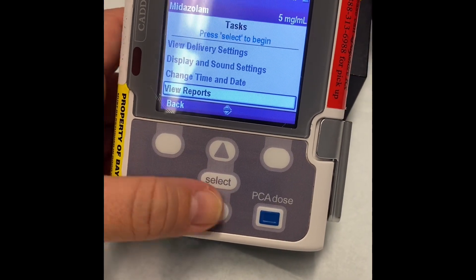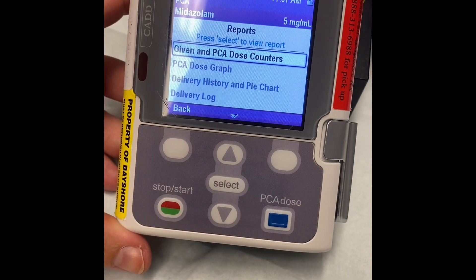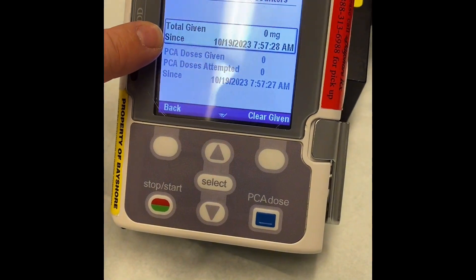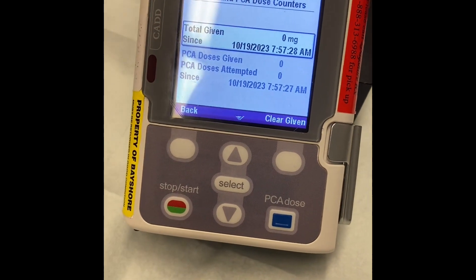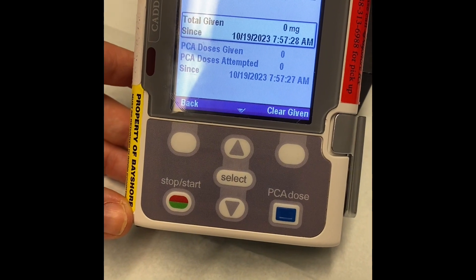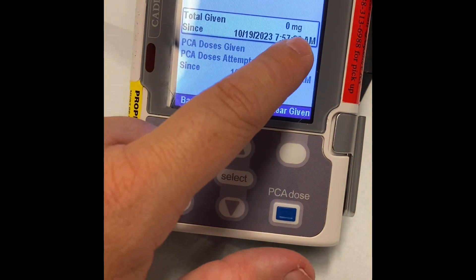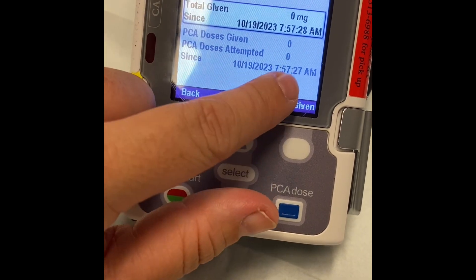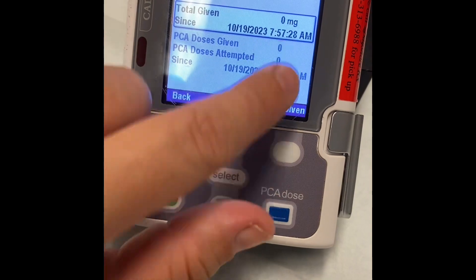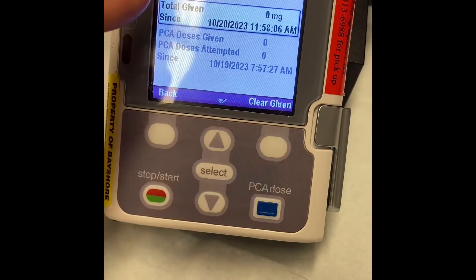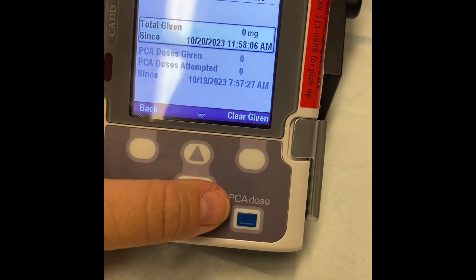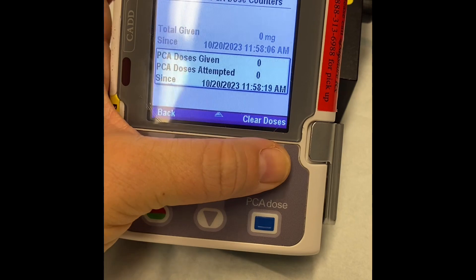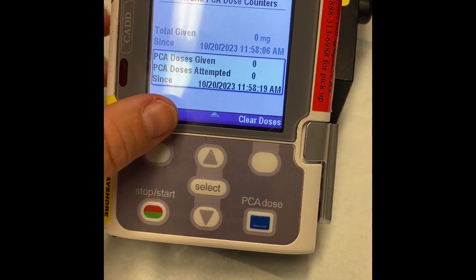Now we want to view our reports — how many times has the patient used the pump? Go down to view reports and select. The first one you're going to select is given and PCA dose counters, then select. You'll see the total given since a specific time and date. These will usually be numbers, but this patient isn't using the pump right now so they say zero. Write down the total given since, then clear so it goes back to zero — note the time and date has changed to now. Go down to doses given, doses attempted, write these down, and select clear doses. Now everything reads zero and is current with the time it is now.